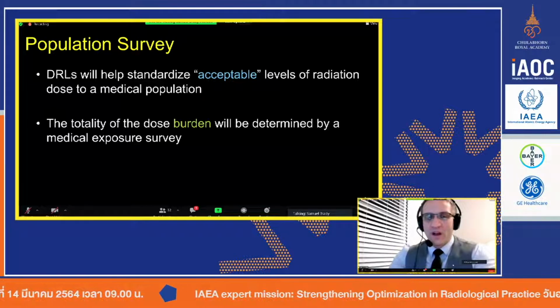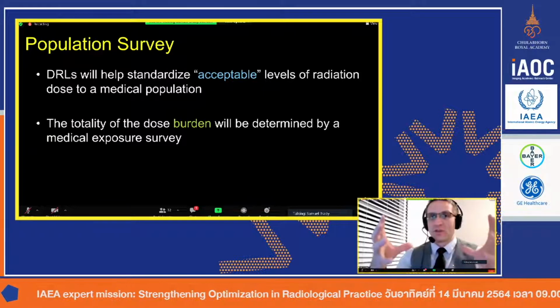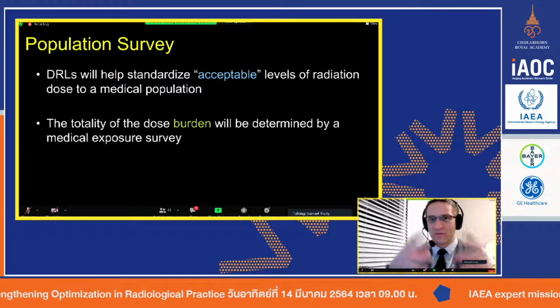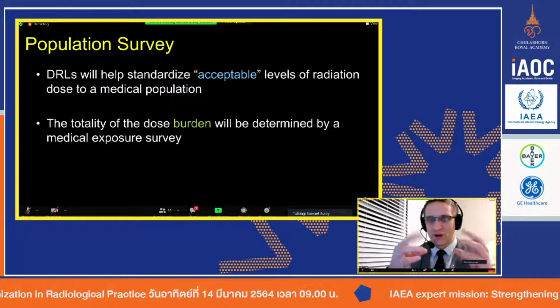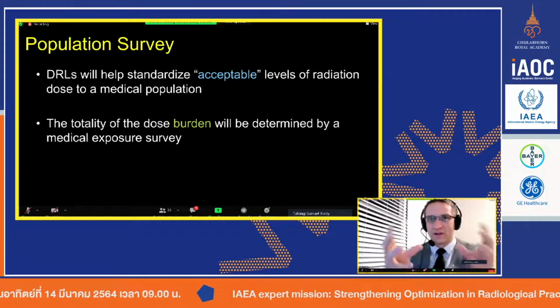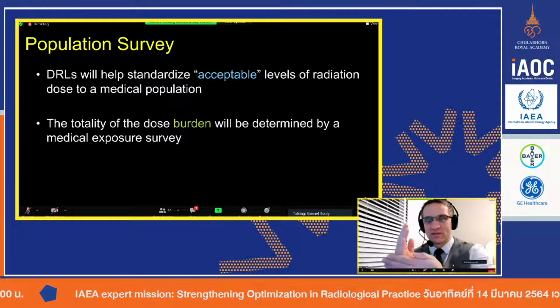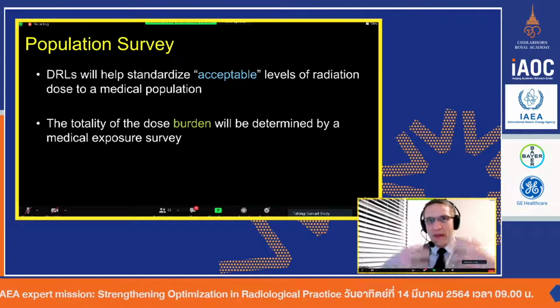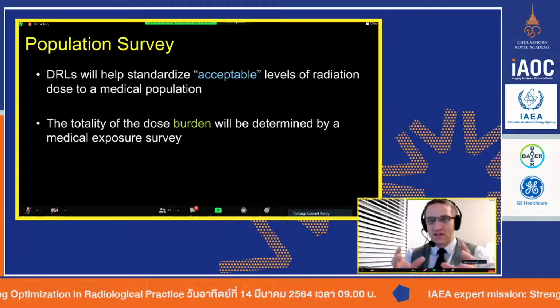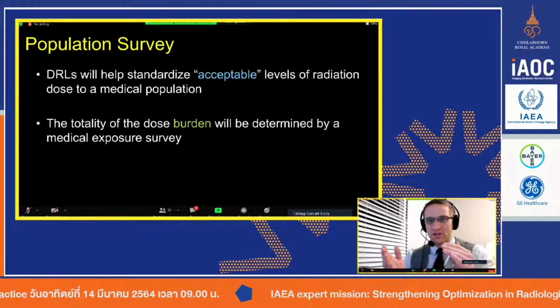So when we talk about radiation dose, remember, this is the big picture here. We're talking about diagnostic reference levels. And how do we use diagnostic reference levels to optimize dose? So we send off all that data, Dr. Panru Thai and her team, they've established Thai national DRLs. And now those numbers are going to come back to the hospital. And those values we're going to use in our optimization team to make an informed decision on what we do.